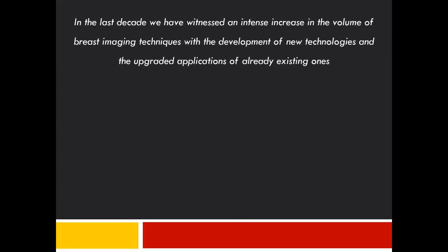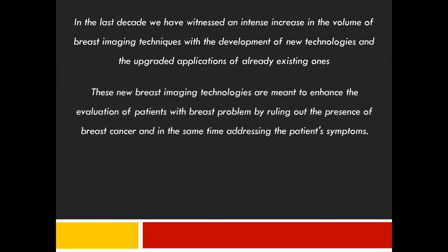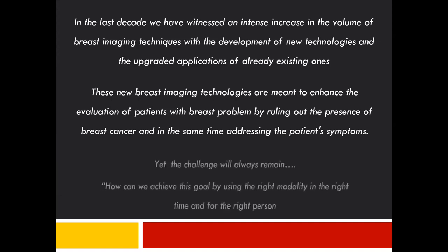And to end my lecture, definitely in the last decade, we have witnessed an intense increase in the volume of breast imaging techniques with the development of new technologies and the upgraded application of already existing ones. These new breast imaging technologies are meant to enhance the evaluation of patients with breast problems by ruling out the presence of breast cancer and at the same time addressing the patient's symptoms.